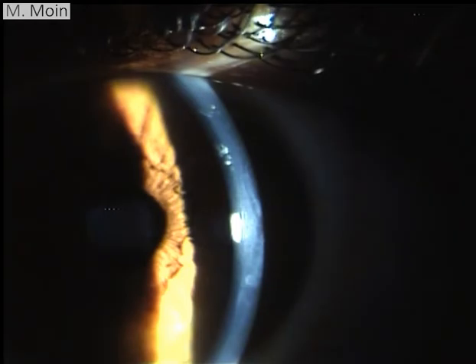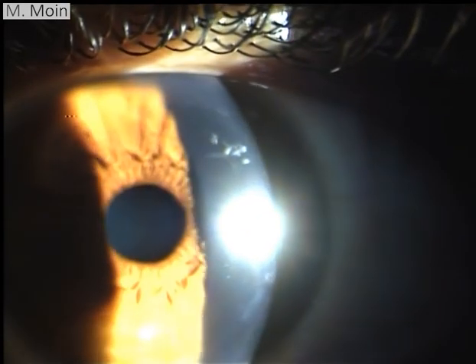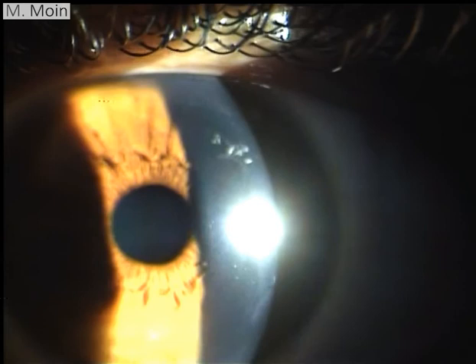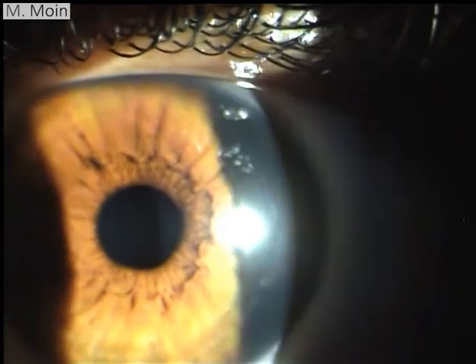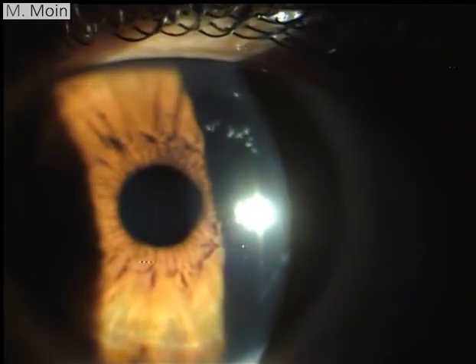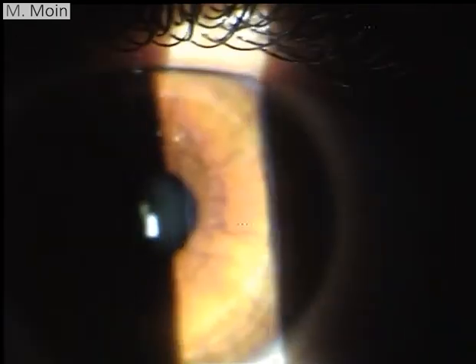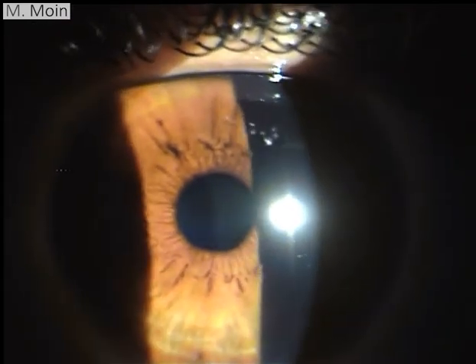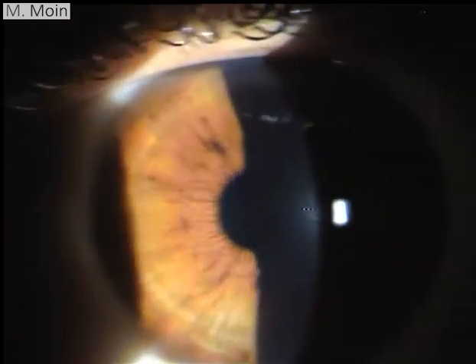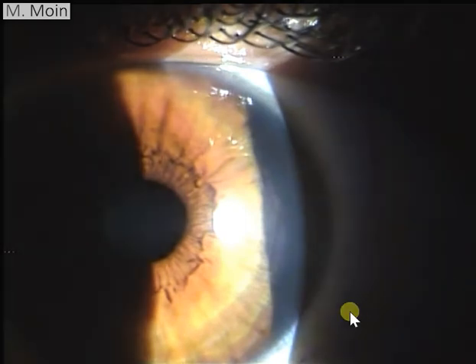When actually examining the cornea, you need to go to a higher magnification. I'm producing a diffuse beam and you're seeing the reflection of the surface of the cornea. There are many techniques - you can do retro illumination of the iris, and retro illumination of the endothelial cells can also be done.